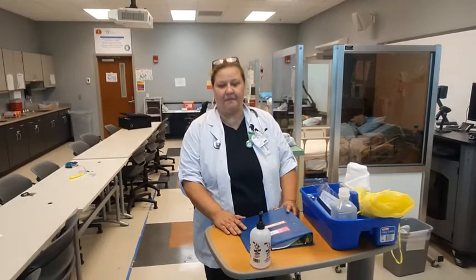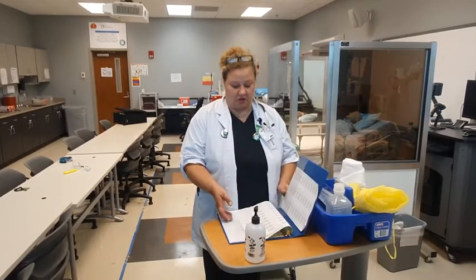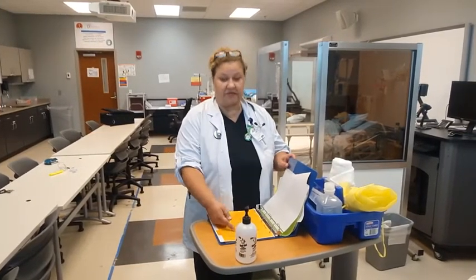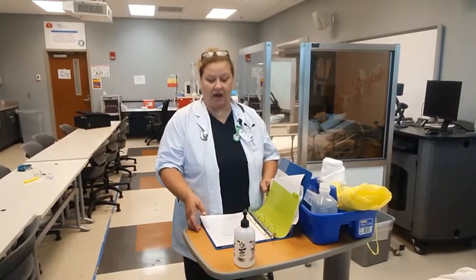This is going to be tracheostomy care. Review your facility protocols for trach care. So you'll take the chart, you'll open it up, and review it for general consent and specific orders for trach care. I have specific orders for trach care, and allergies. And the patient has no allergies.